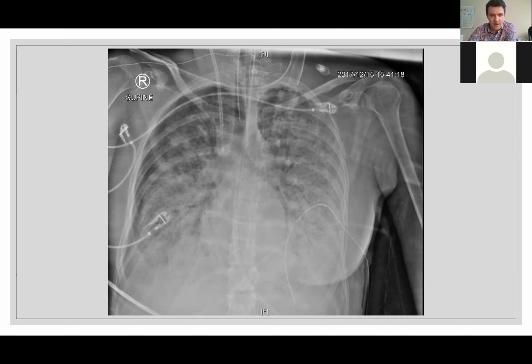Now, really what goes on in ARDS, you can see from this X-ray, is nothing good. It depends on what the etiology is, but what we really want to think about from our ventilator strategy and from the ICU is how do we prevent this picture from getting worse? And there are 4 main types of trauma that we organize our ventilatory strategy around in ARDS.